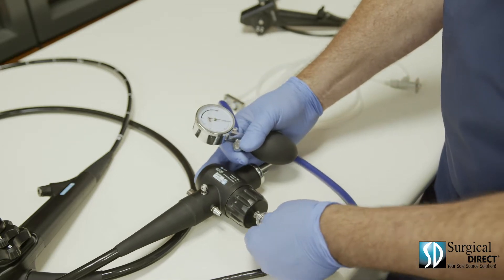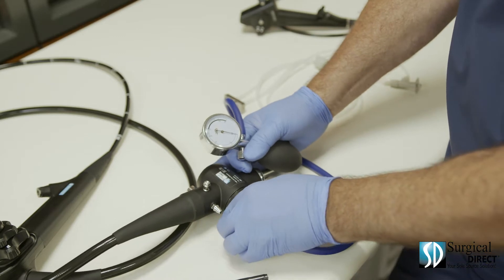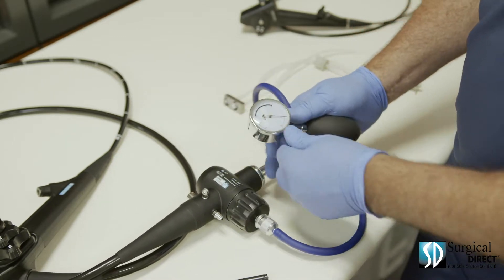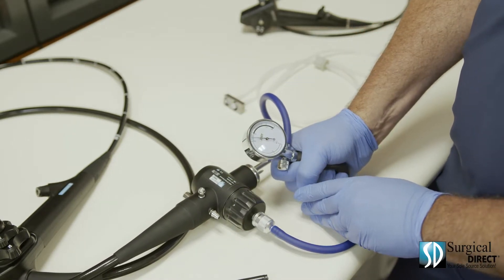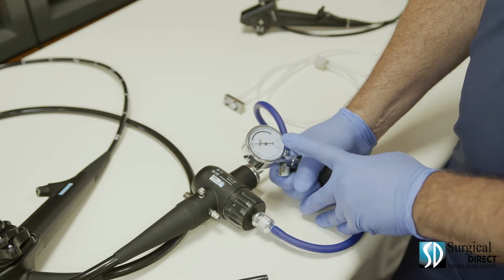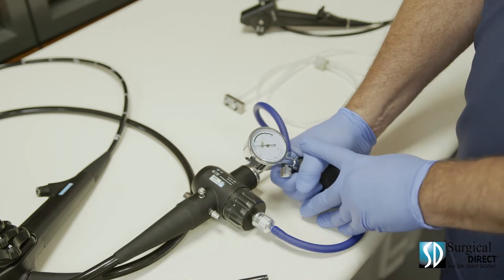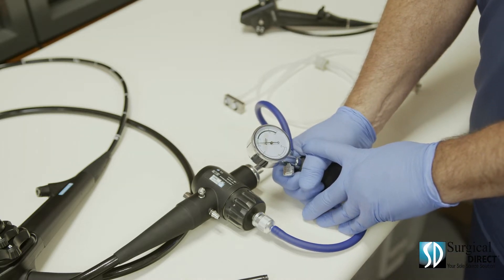Attach the leak tester to the end of the soaking cap. Make sure it's locked on and make sure the cap is tight. Using the hand pump, pump the scope up until the gauge is in the test area. Watch the gauge and make sure it doesn't drop. If it doesn't drop after a few seconds, you're ready to submerge the scope.